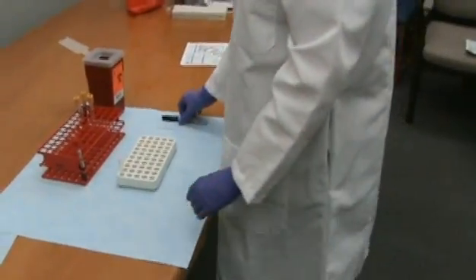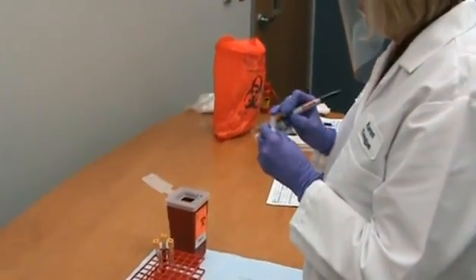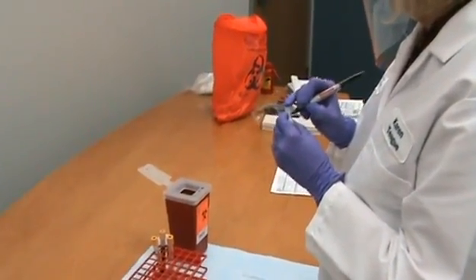Label the transport container appropriately with the patient's information. Be sure to use a permanent marker because other marker types can become smeared and unreadable.